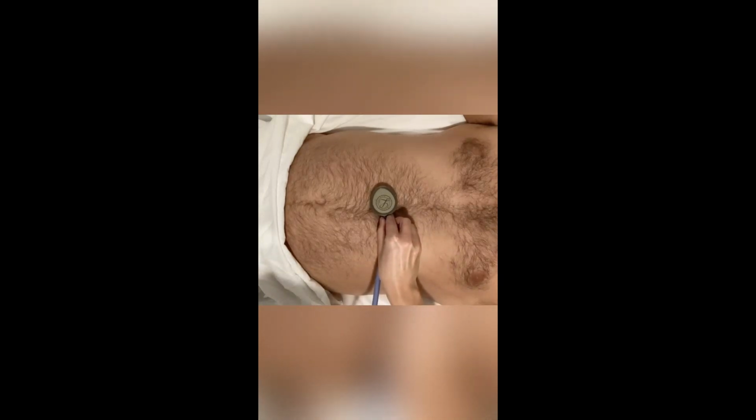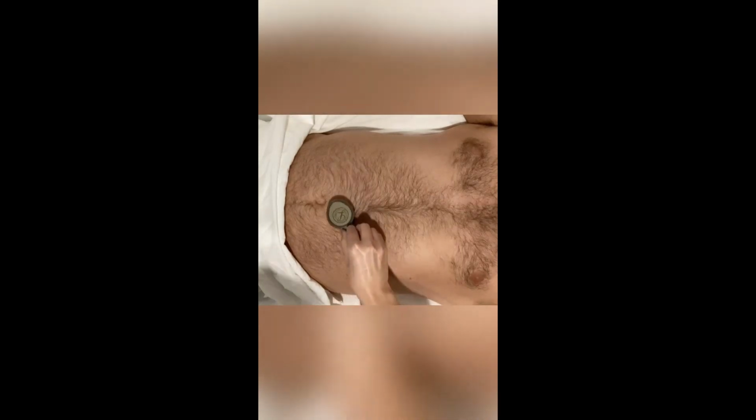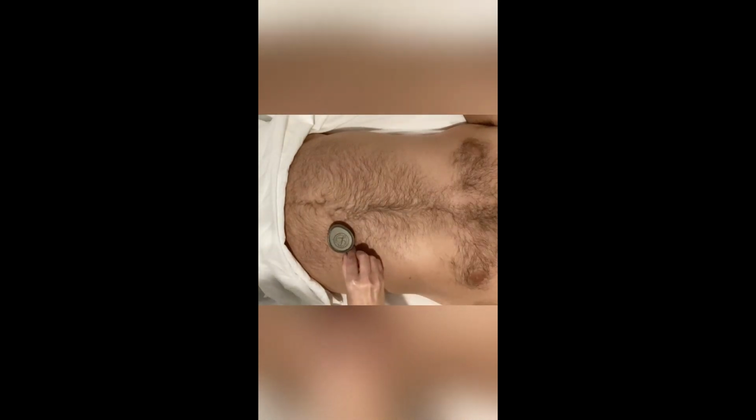We are listening for a swoosh sound, and it's not noted. Then we're moving to the right renal artery and left renal artery. Then we're moving to the iliac artery, which is a little bit below the belly button. And then listen to the other side as well.